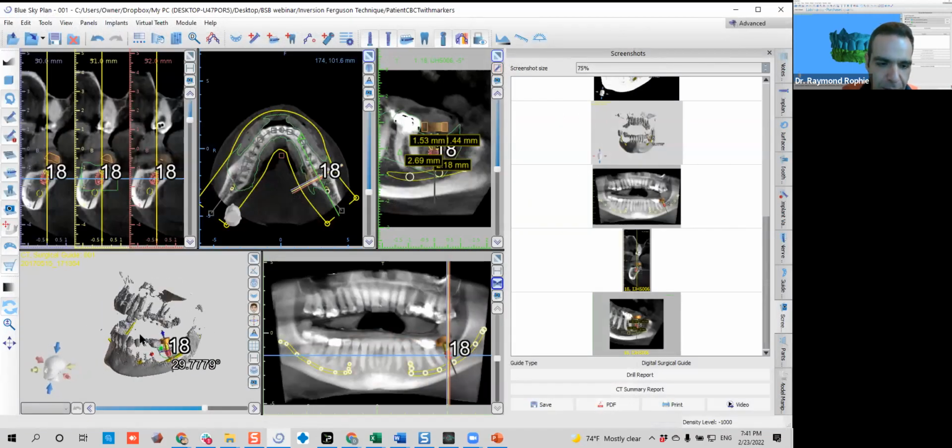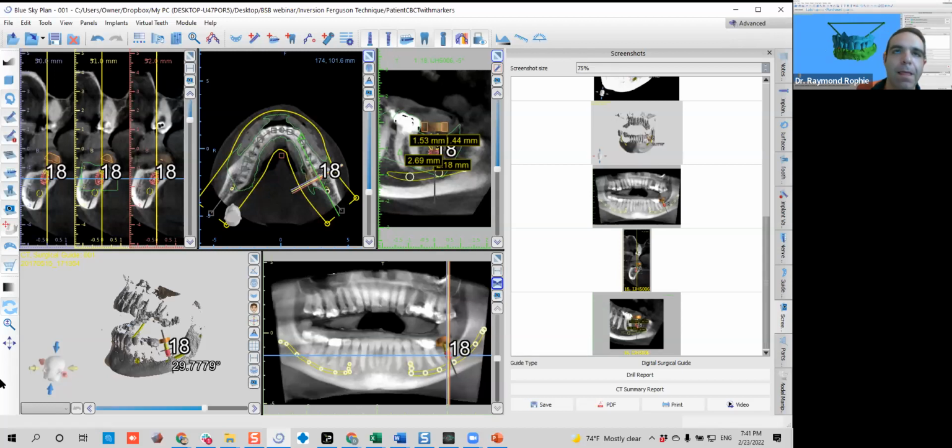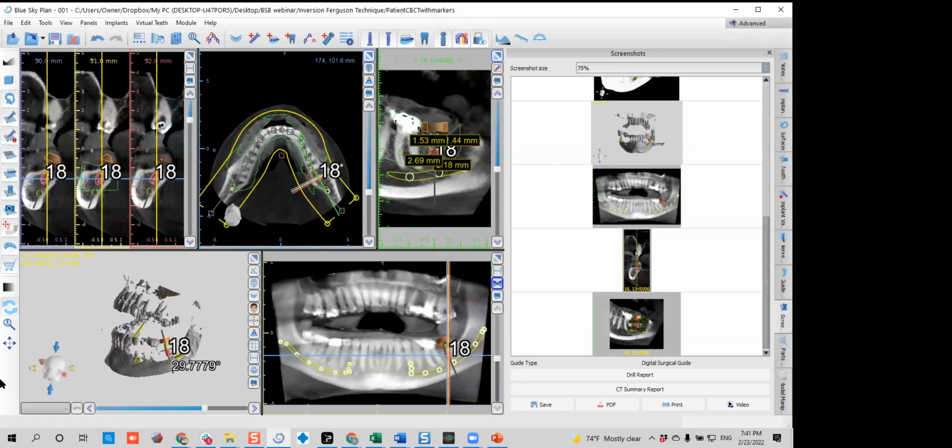Okay, I hope there are many questions, because now I think I talked a lot, and I will go now to the crown and bridge module. So if there are any questions, I hope I didn't bore you too much. I've been answering some of the questions that came in, but we've received a few requests to demonstrate how to turn the tooth into a crown. Oh yeah, that's exactly what we're going to do. Yes, correct, perfect. So maybe we could use that to wrap up the webinar.